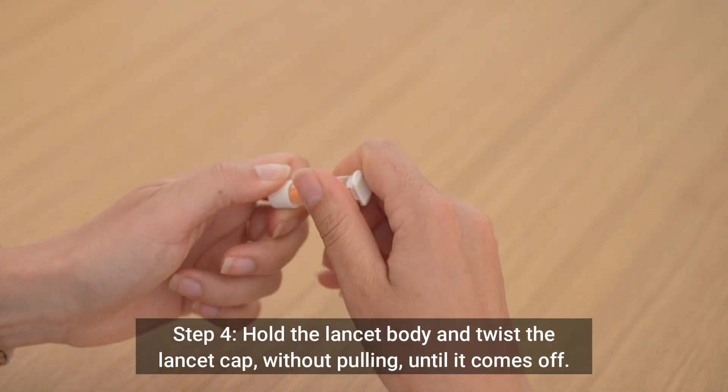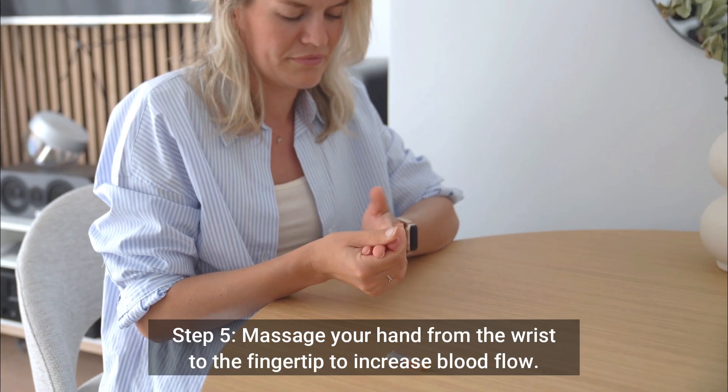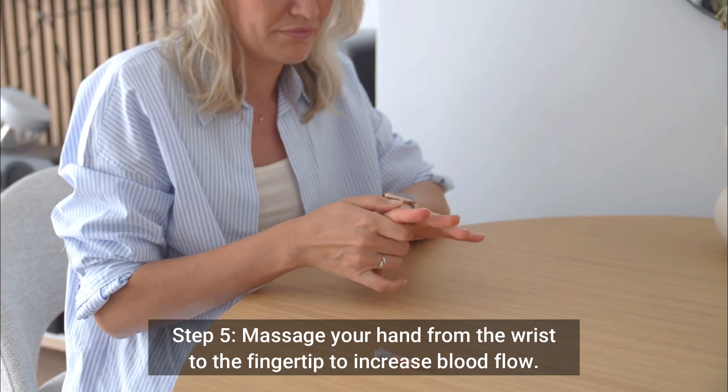Step 4: Hold the lancet body and twist the lancet cap without pulling until it comes off. Step 5: Massage your hand from the wrist to the fingertip to increase blood flow.